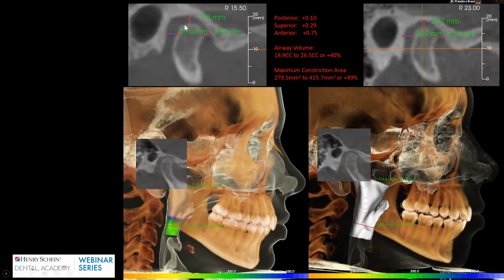First of all, the stability of the TMJ. Remember, this is the external auditory meatus, beautifully rendered by a cross-section of the TMJ using the CBCT. Then I measure the articular spaces. The condyle is positioned concentrically and ends concentrically positioned, so there is no discrepancy in the condylar position.